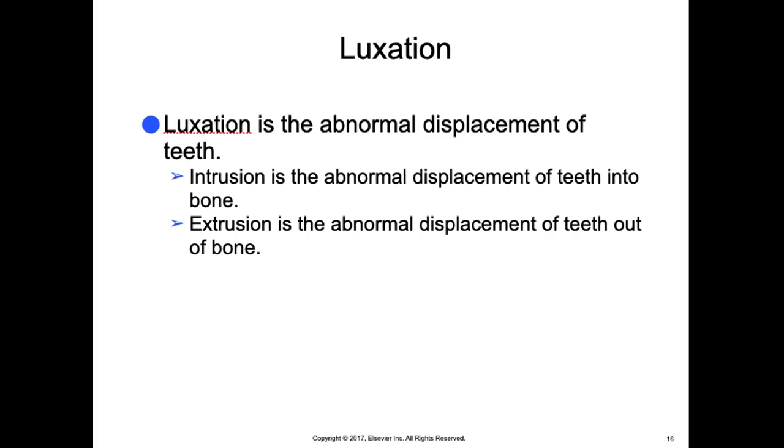Teeth that have been luxated should be evaluated by a periapical image and examined for root and adjacent alveolar bone fractures, damage to the periodontal ligament, and pulpal problems.